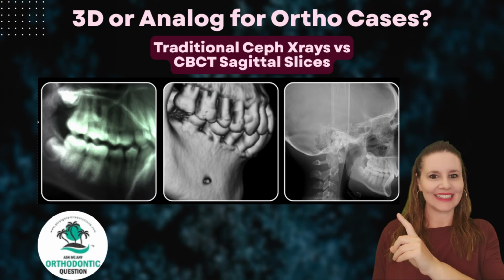And again, I'm not going to tell you whether you need a Ceph or not, because you need to know your own Dental Practice Act, what's standard of care in your state or your country. That's not my job. Most orthodontists take Cephs on every single patient. Why? Because that's just what we do. That's what we're trained to do.